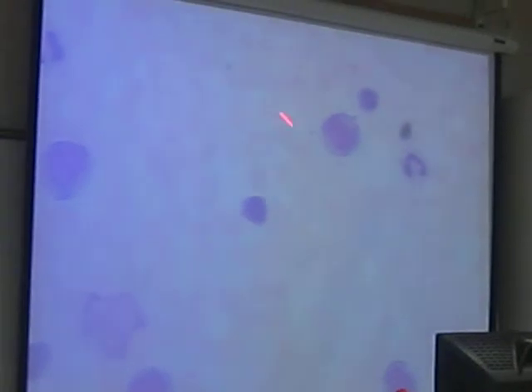We'll start first with the erythrocytes. So the red blood cells are all these pink cells. It should be easy to identify. As you scroll around, you'll see these little, and it's not really in focus, but see these little dots? These little purple dots? Those are your platelets.